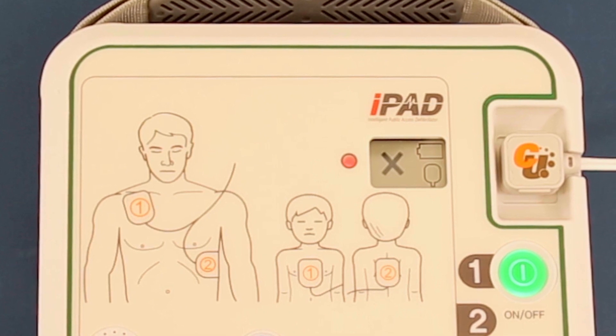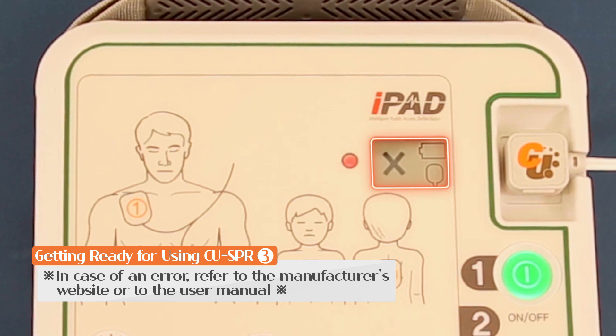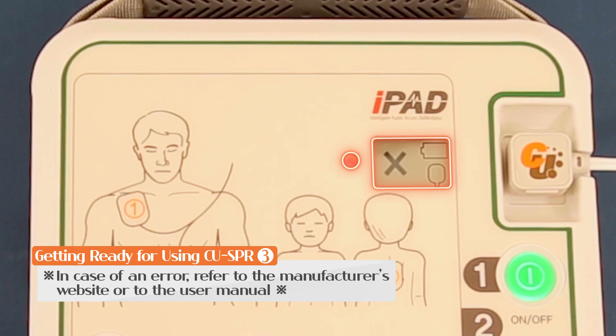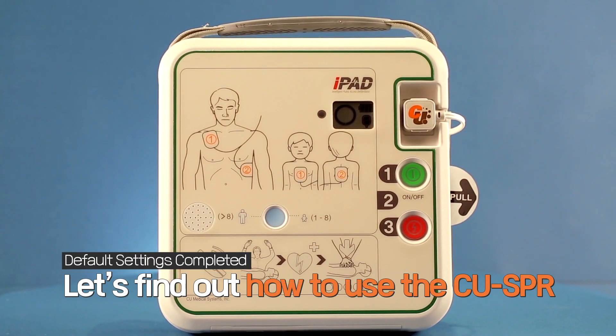If a problem is detected, an error indicator will light up and an X mark will appear. This completes the setup process.